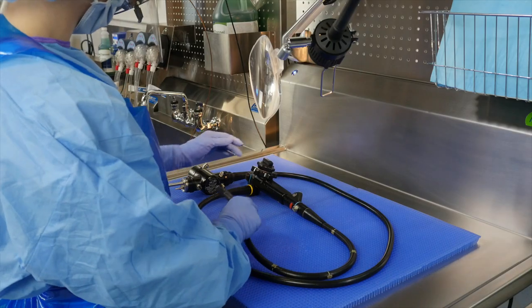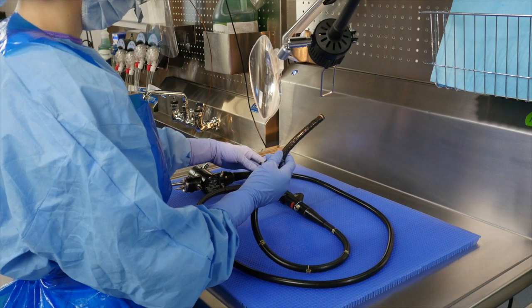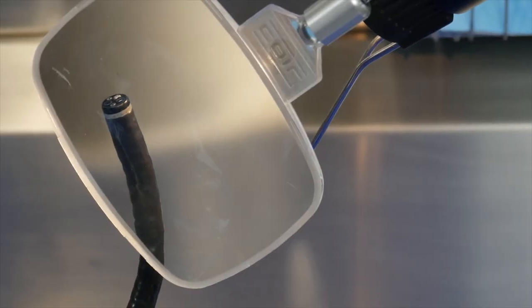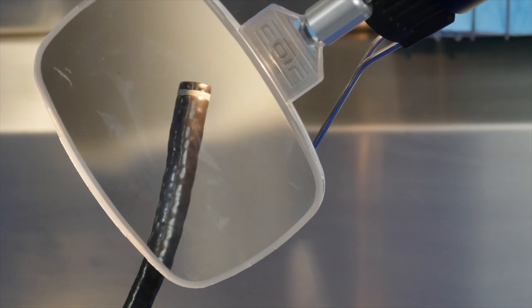The back wall panel organizes accessories to streamline workflow and keeps items easily in reach for staff. The PureLandingPad liner protects the delicate nature of scopes and prevents scope damage from contact with hard surfaces or sink basins.